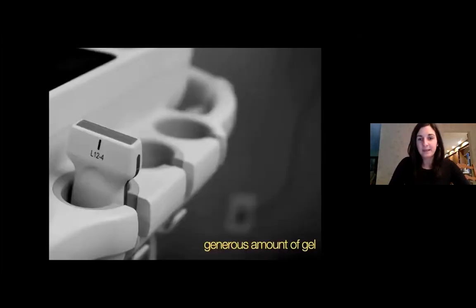Appendicitis. How do you do this? Step number one is, in theory, you want to get the highest frequency probe. Why? Because the appendix is a subtle structure, and with the big curvilinear probe, you might not be able to appreciate what we're looking for in terms of the findings of appendicitis. Like any other disease where patients have pain, try to use a lot of gel to give you a good window so you don't have to push super hard. The gel will help you manage the fact that you need to compress a bit. So the linear probe is actually your go-to probe if you look for the appendix.